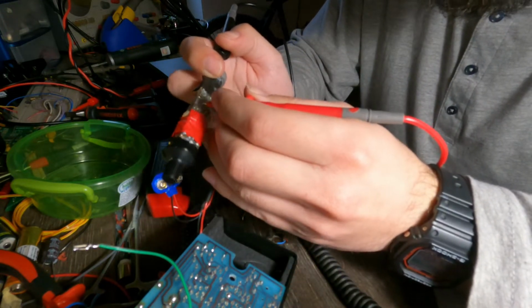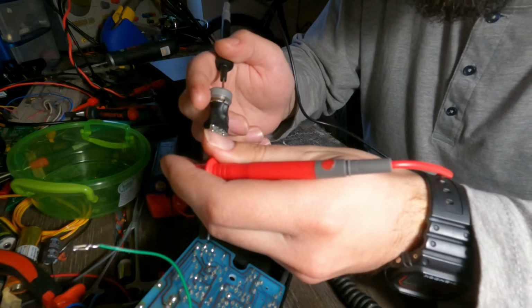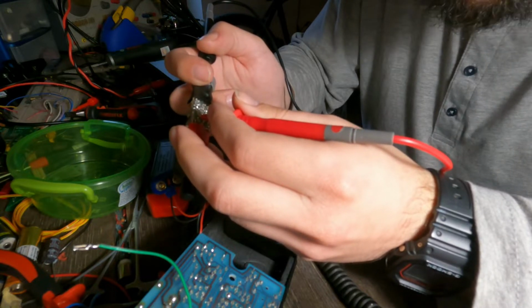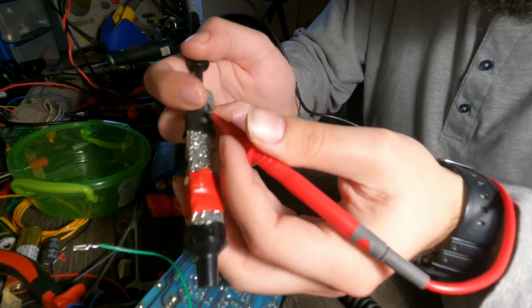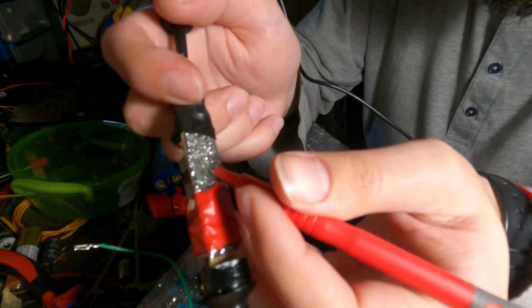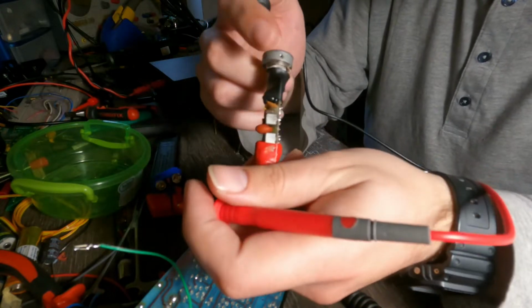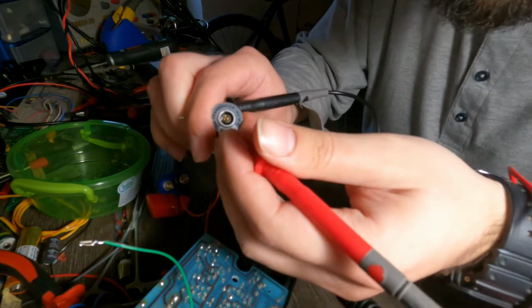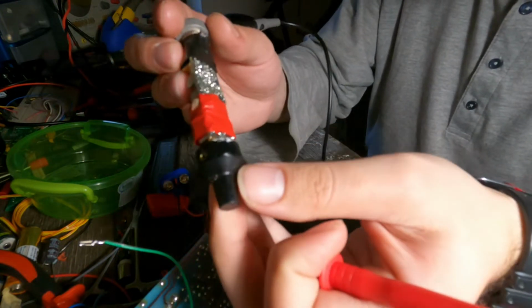So this is also ground. This is also ground. Yeah, I forgot to change the pin. So go to this pin, and what do you know, it's the power line, and you see it's in many points here, so it's this line. And ground. So we have ground, the supply, and the audio output signal from the transducer.